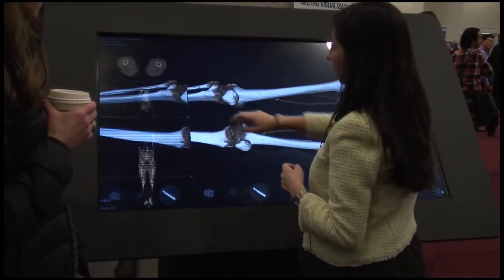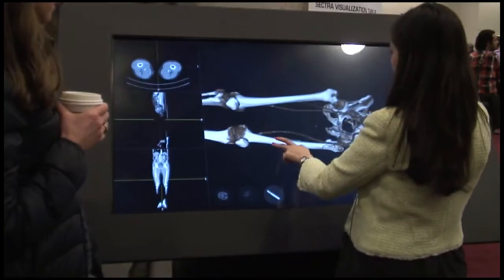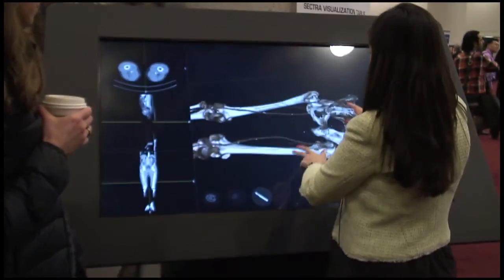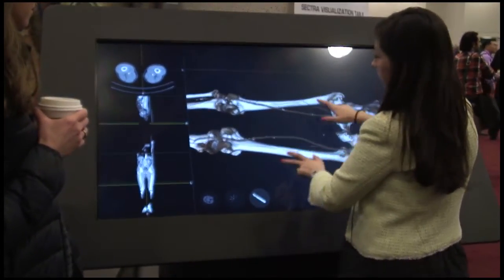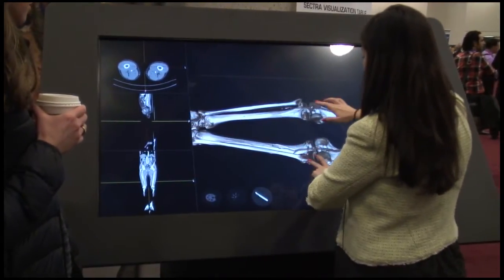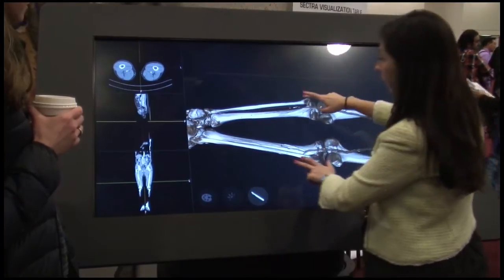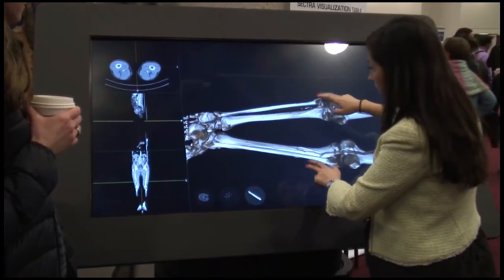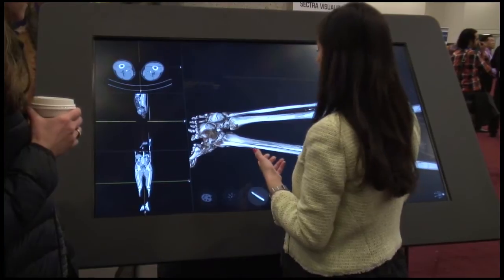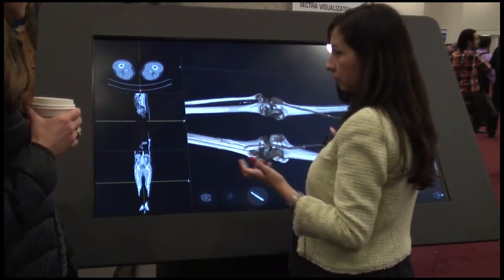I can also put the 3 axes here so the students don't get lost in terms of where we are. I can see all the vascular system. In this case it's also good to relate with the clinical symptoms — for example here it's calcified, so I can explain to the student that this patient is suffering pain while walking. So it's not just traditional anatomy.